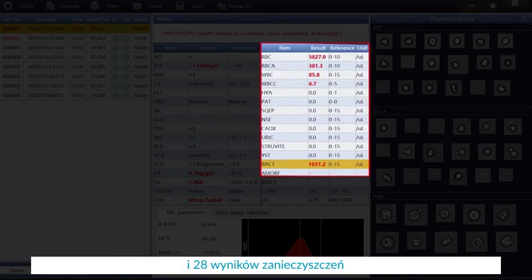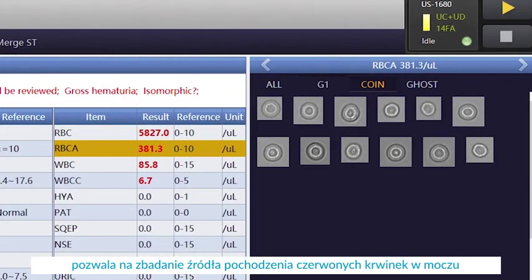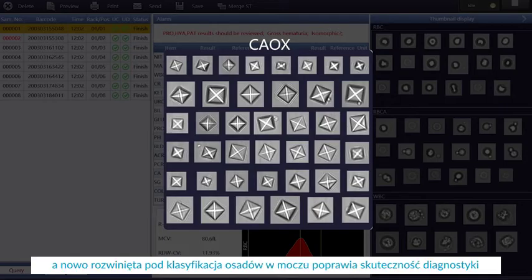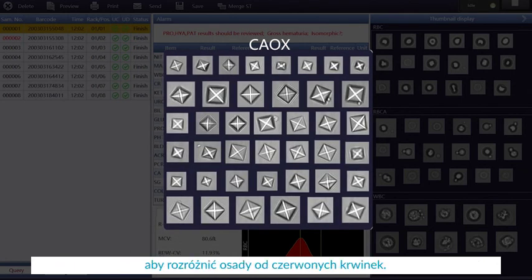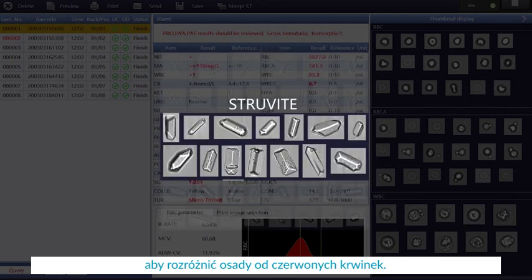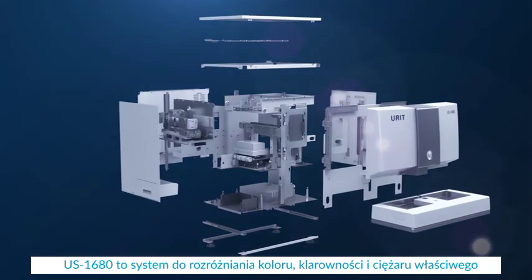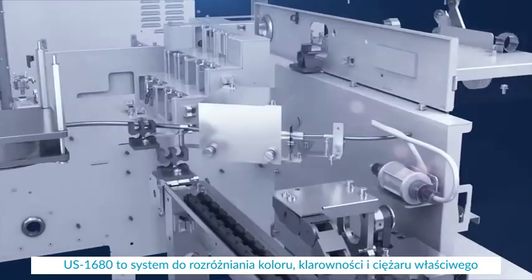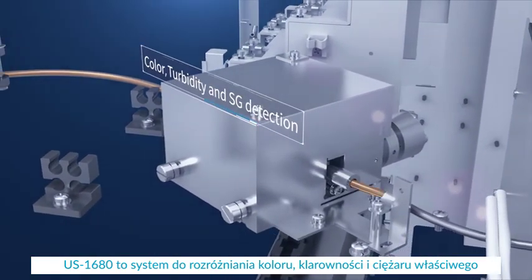The report also includes 28 sediment results. A new sub-classification function of red blood cells helps to identify the source of red blood cells, and a newly developed crystal sub-classification improves accuracy in distinguishing crystals from red blood cells. The US 1680 is an integrated system to detect color, turbidity, and specific gravity.